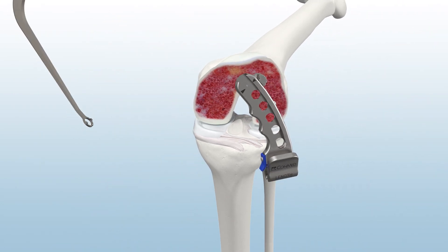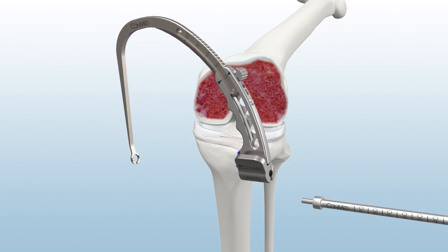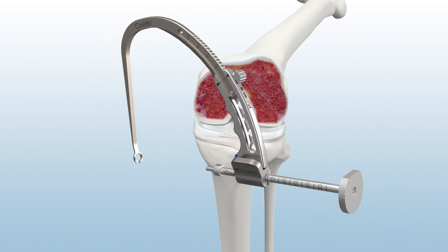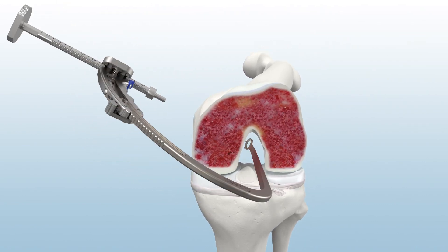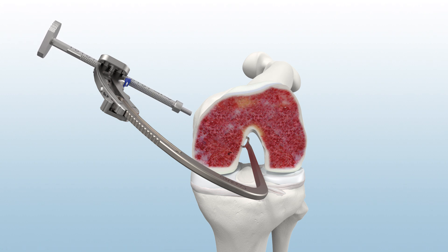Assemble the Infinity Modular Guide System using the femoral footprint guide arm and the all-inside guide sleeve. Through the anteromedial portal, place the footprint of the guide over the femoral PCL remnant and advance the guide sleeve to skin.